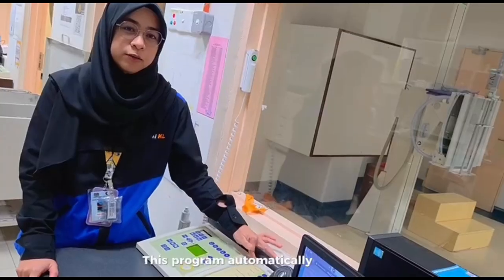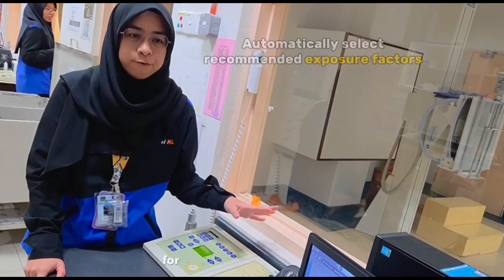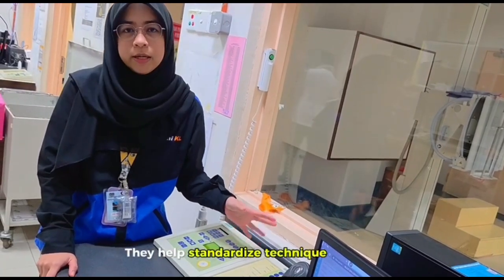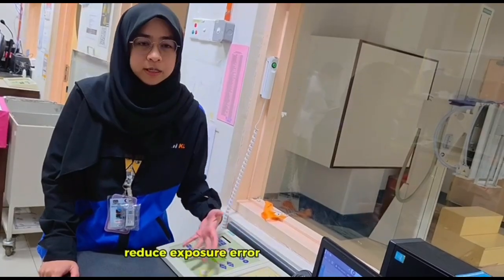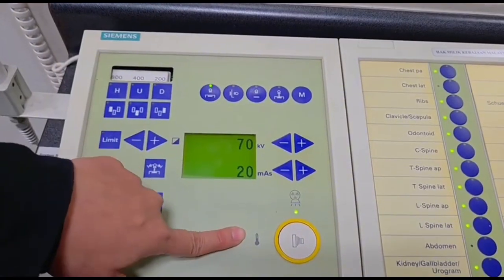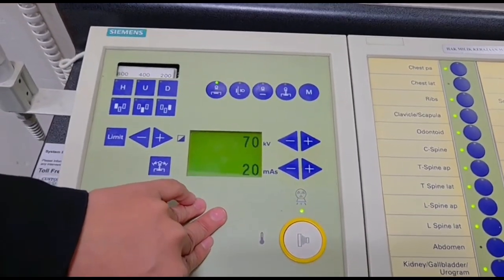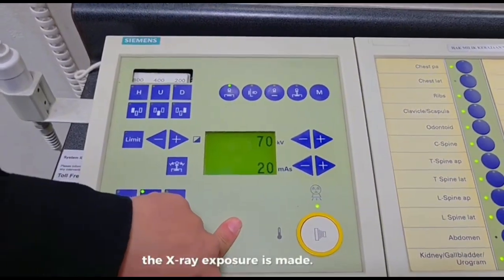This program automatically selects the complete exposure factors for each examination. They help standardize technique and reduce exposure error, especially for routine examinations. Okay, this is the exposure button highlighted with a yellow circle. Okay, when the button is fully pressed, the X-ray exposure is made.